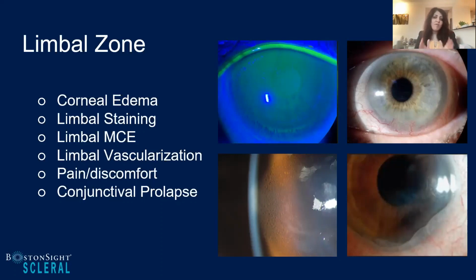The best way to find out if you are having any issues is, one, make sure you look at your scans, make sure you use your good optic sections to scan over the limbal region, and take the lens off and stain the cornea to make sure you see what's happening there, and take a good look at the cornea without the lens on to make sure that there's no problems. If you don't look for this short term, it's going to come back and haunt you long term. And we've seen this quite a bit with especially the neovascularization, where that eye is just crying for help. And that's a source of really paying attention to that limbus.